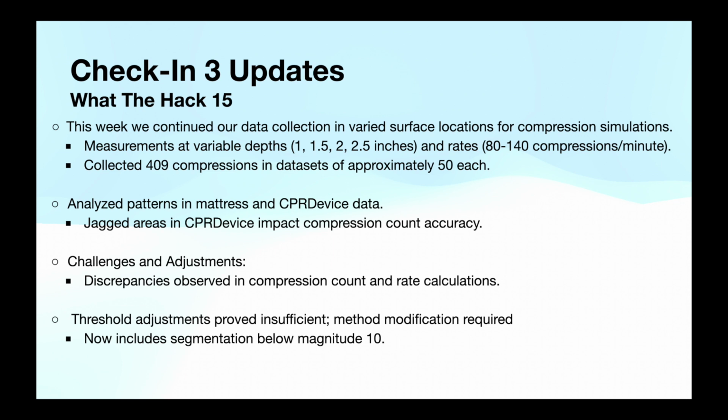This week, we continued to collect data at different locations and compression rates. Data was collected using the CPR device, as well as at a variable depth without the device using a mattress, cushion, and couch. We faced some challenges with our segmentation processes, and we were required to make some adjustments which produced promising results.